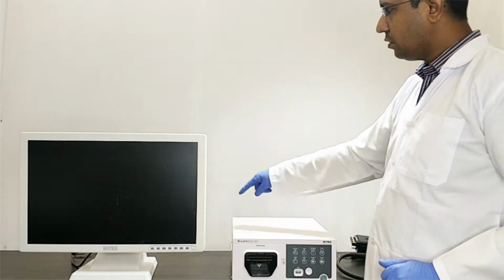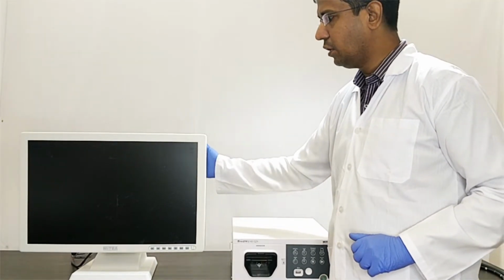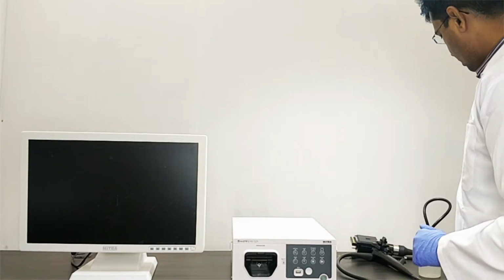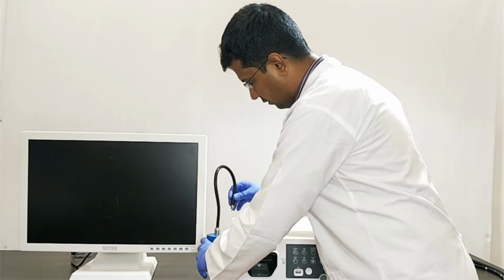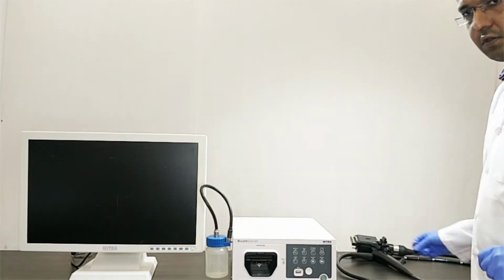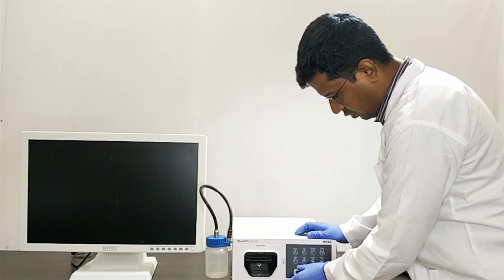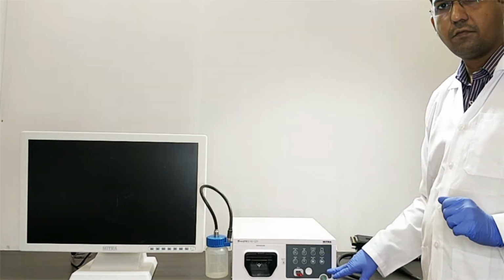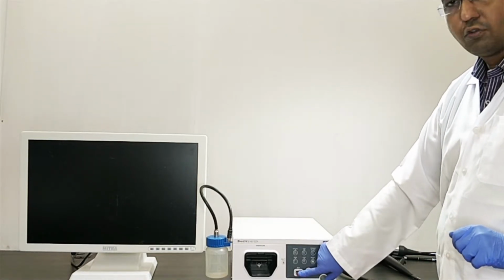The output from the video processor is connected to the input of this monitor. Now I am connecting this water container and this pen drive. So whatever images you capture or the recorded video is directly saved to your pen drive.